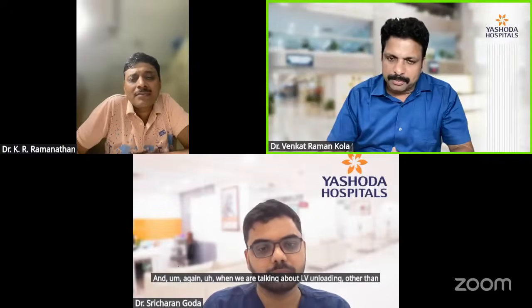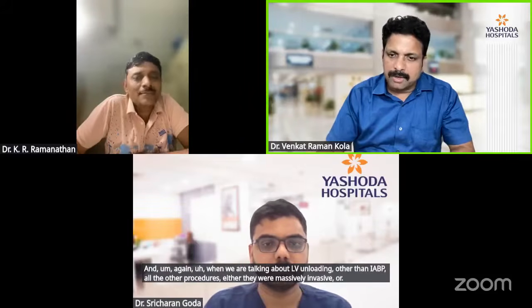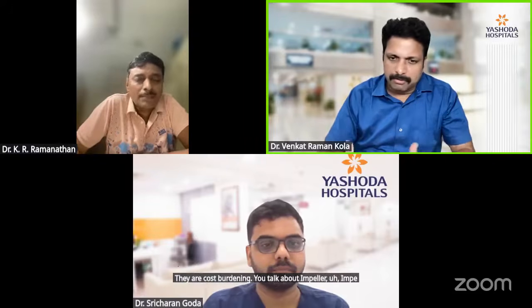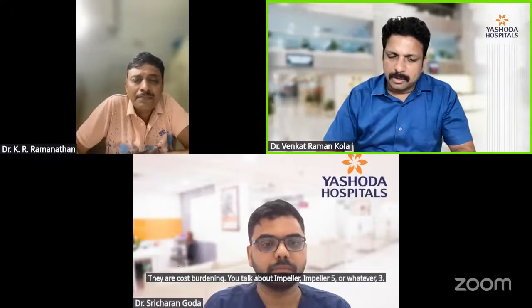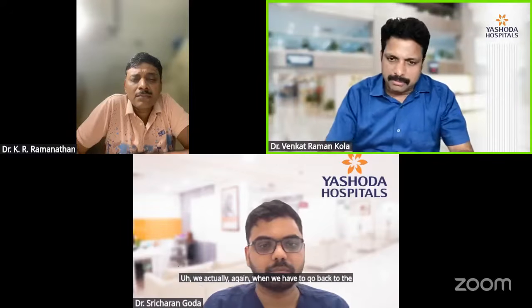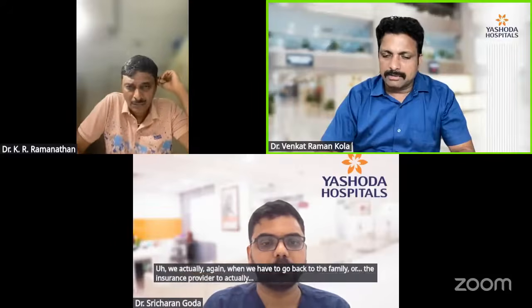When we are talking about LV unloading, other than IABP, all the other procedures are either massively invasive or cost burdening. If you talk about Impella 5 or 3.5, it adds a huge amount of cost, and that is one of the reasons why we have to go back to the family or the insurance provider to talk about the add-on.